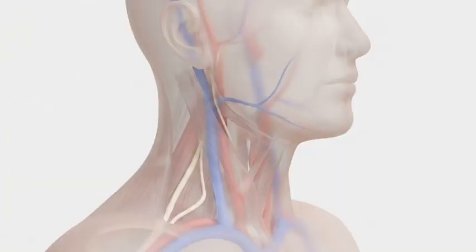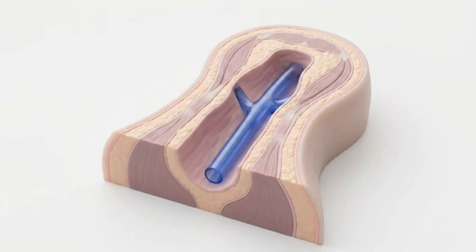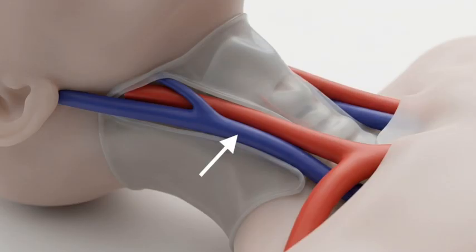Now we transition to central venous lines. One of the primary insertion zones for these lines is the neck. This outlines landmarks for finding the internal jugular vein. Mapping points at the ear, mid-neck, and clavicle reveals the distinct anatomical triangle containing the vessel. The internal jugular, or IJ, runs deep in the neck. Think of it as the inside jugular, sitting protected within the carotid sheath.